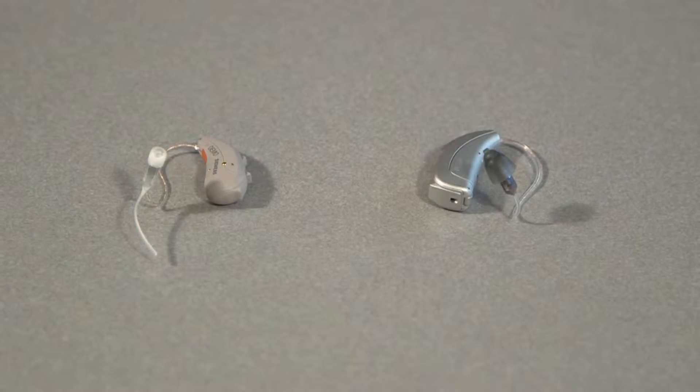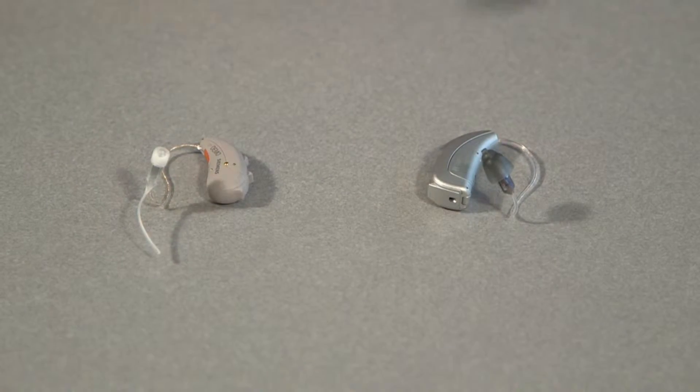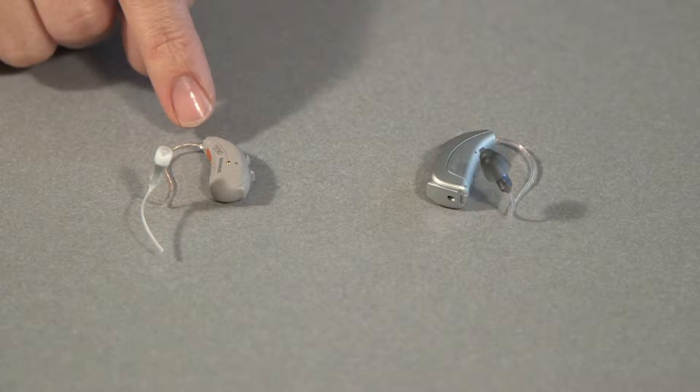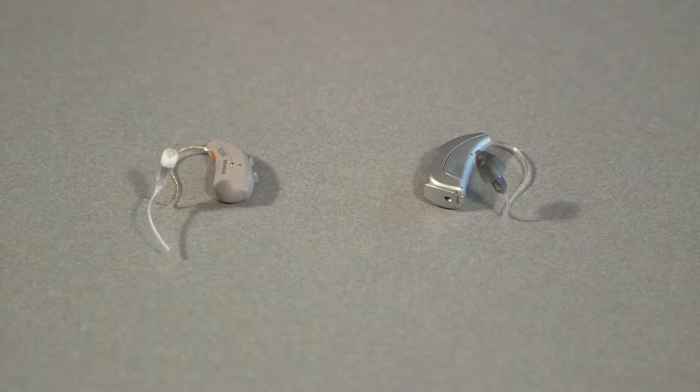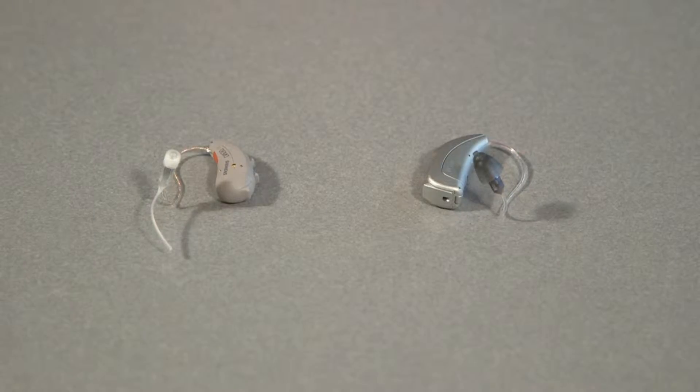If you have a receiver in the ear hearing aid which is the style of hearing aid that sits on the back or the top of your ear and has a little wire that runs down the front, these are the steps that you'll take if the hearing aid doesn't sound like it usually does.